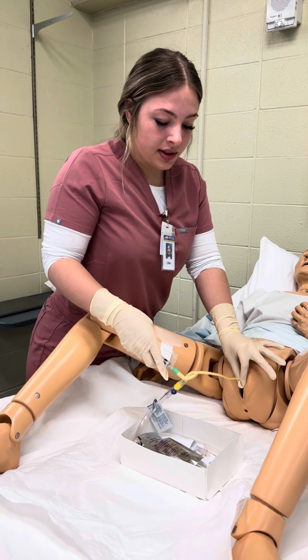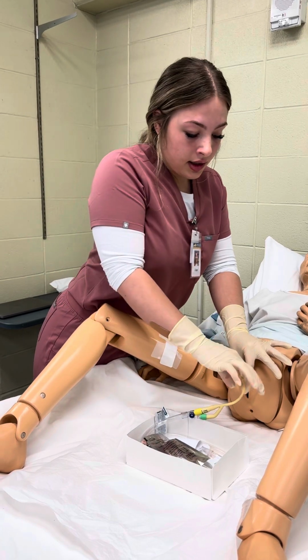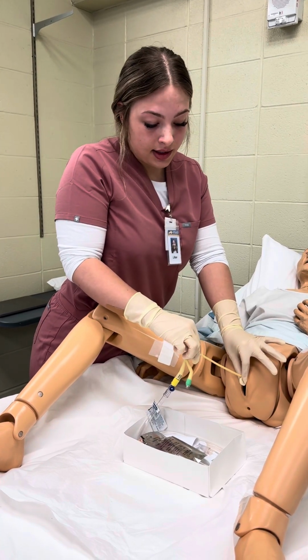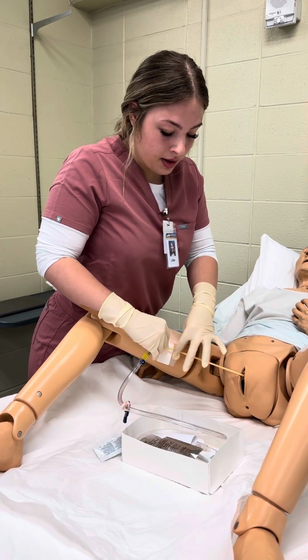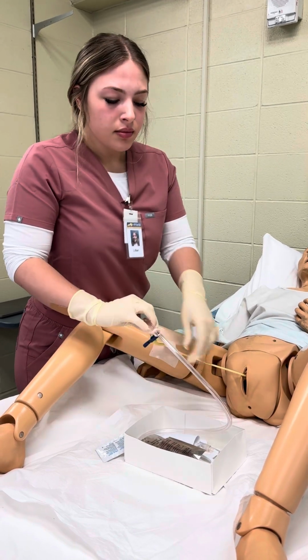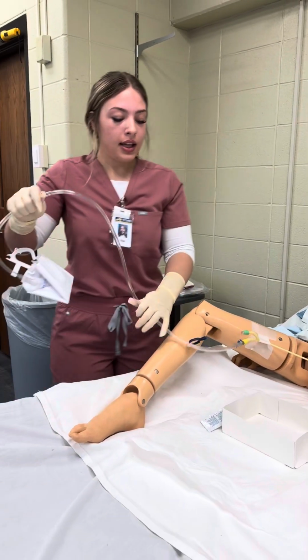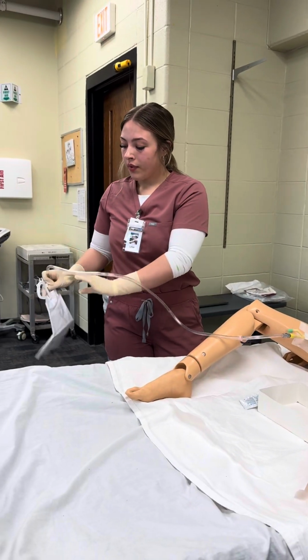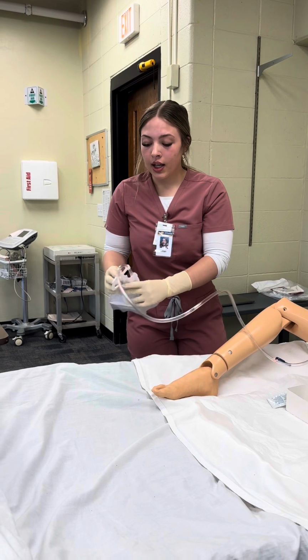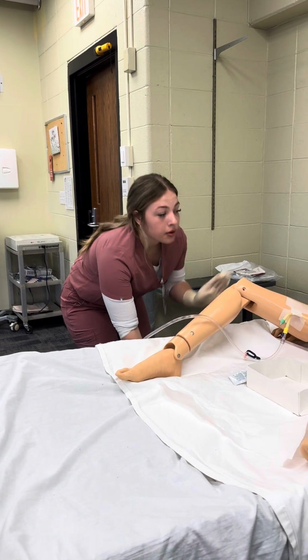Okay, once the balloon is inflated, I take that off. And I can now let go because it is stabilized, and I'm going to stabilize it to the leg. Going to go ahead and get my bag out, make sure that there are no kinks in the line, and put it on a non-movable part of the bed, which is below the bladder.